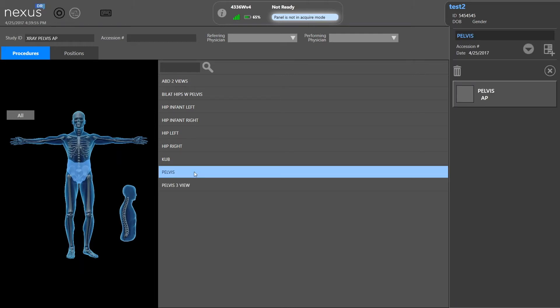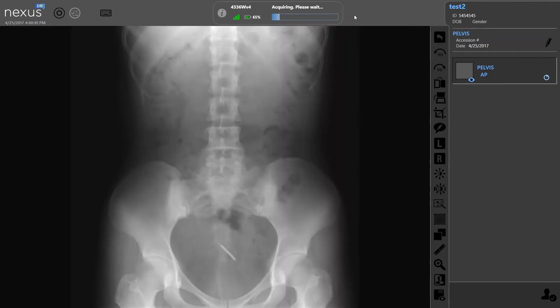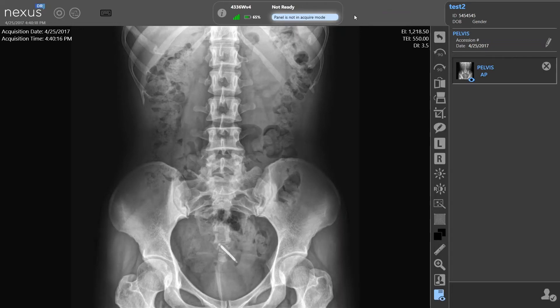So we'll choose a pelvis. Once we've chosen it, we click on the box over at the right side. You'll see that the panel is showing as ready. When you see the green bar is full for ready, you're ready to make your exposure. Once the image is taken, it's going to show you a preview in one to two seconds, and your full processed image is going to appear in four to six seconds.